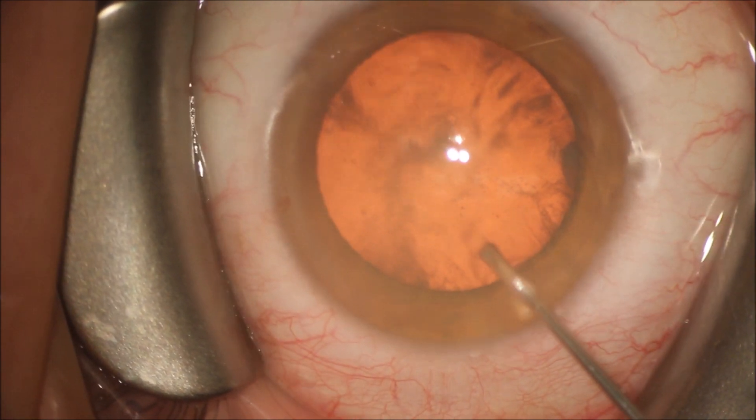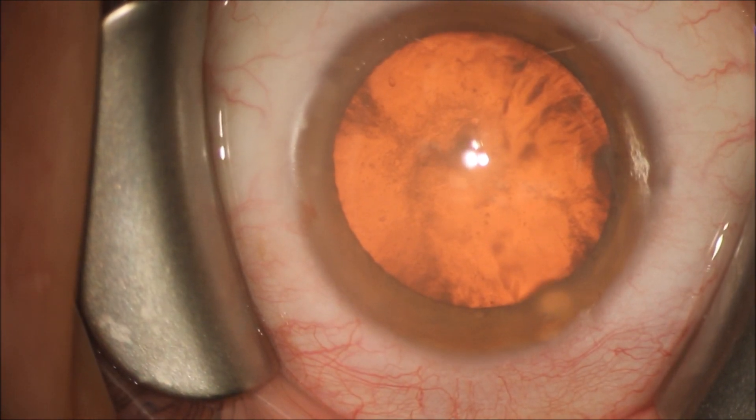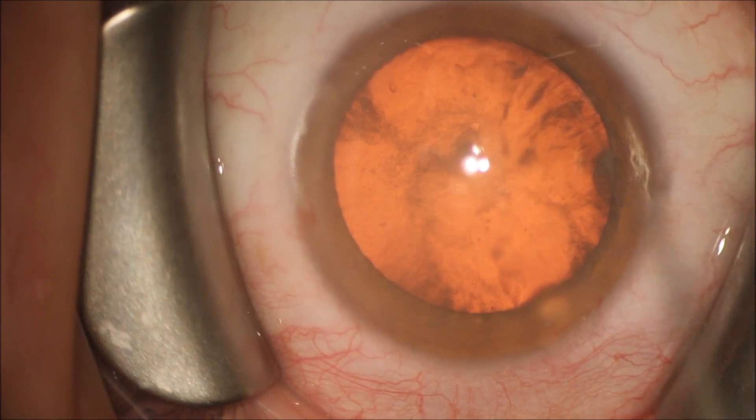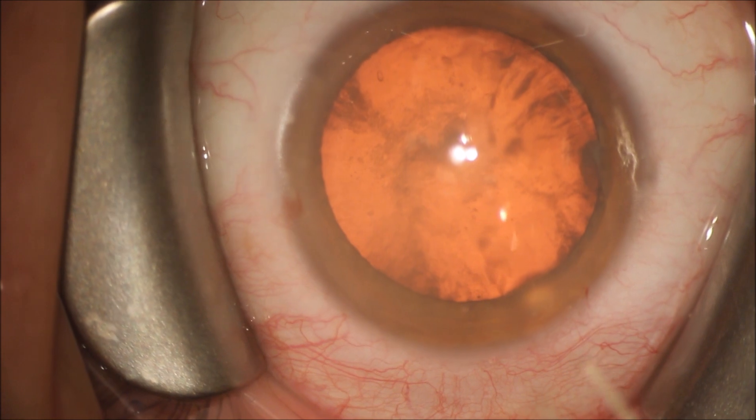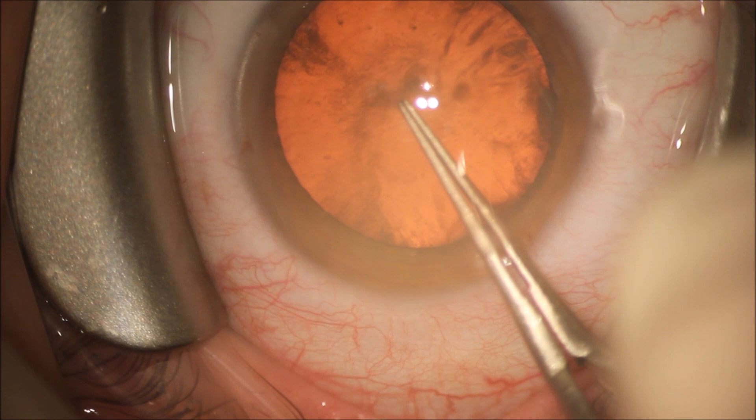You can see that we're going to inject viscoelastic — that's the gel-like substance that keeps space in the eye as we operate, protecting the delicate structures of the cornea from the effects of trauma from surgery.